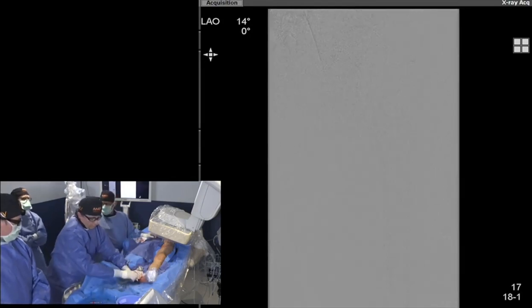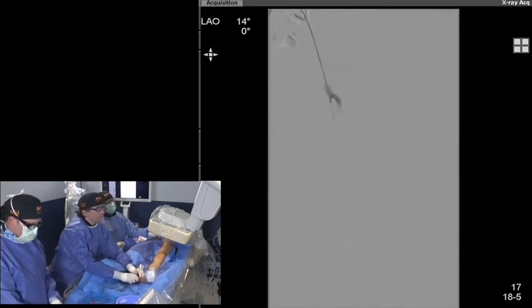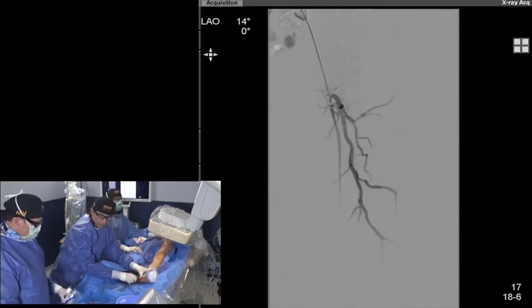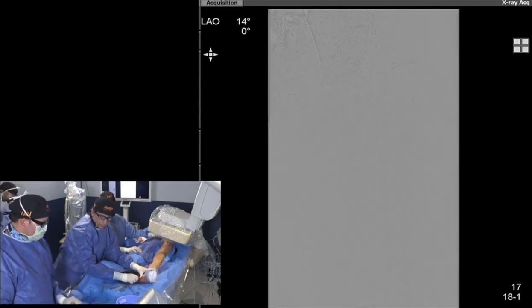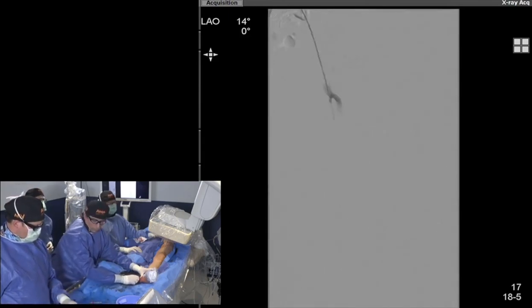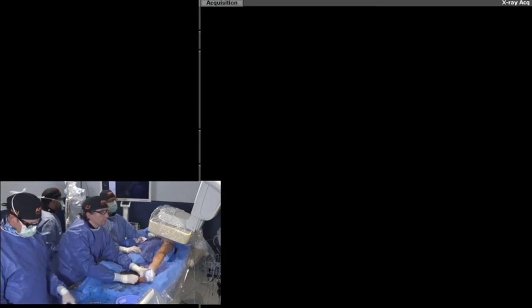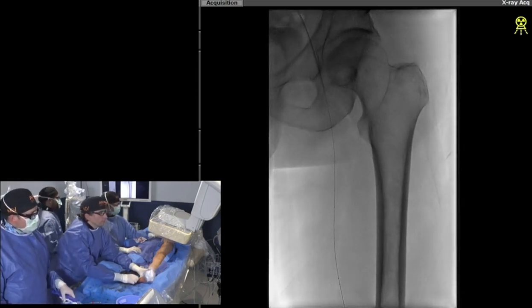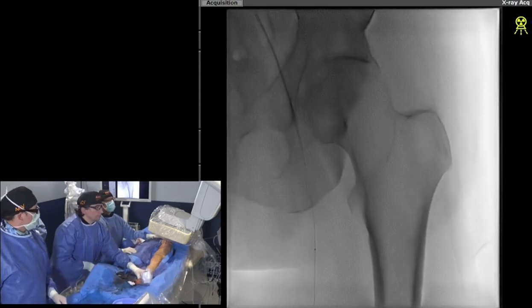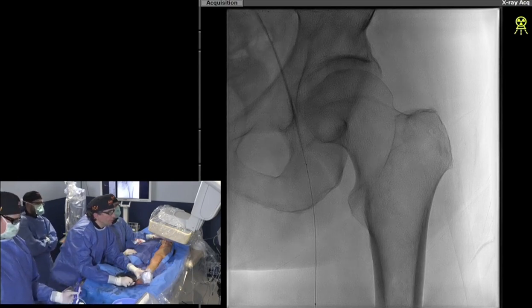We did another quick run as the trial suggested. The re-entry point is right there at the proximal segment of the SFA. Was any part of this subintimal? Yes, we said that before — but he was asking about the common femoral and origin, and he's beyond the origin in the lumen. That's very different from being subintimal at the origin where you really risk losing the profunda. When he goes to deploy a stent, using a steep left anterior oblique about 45 degrees is important — a lot of people miss the ostium without that view.